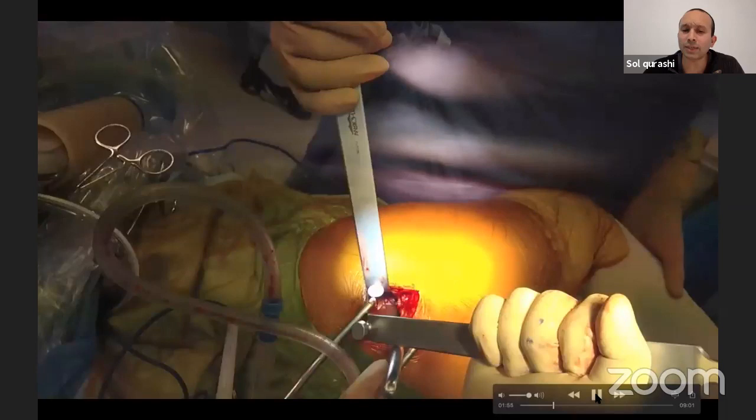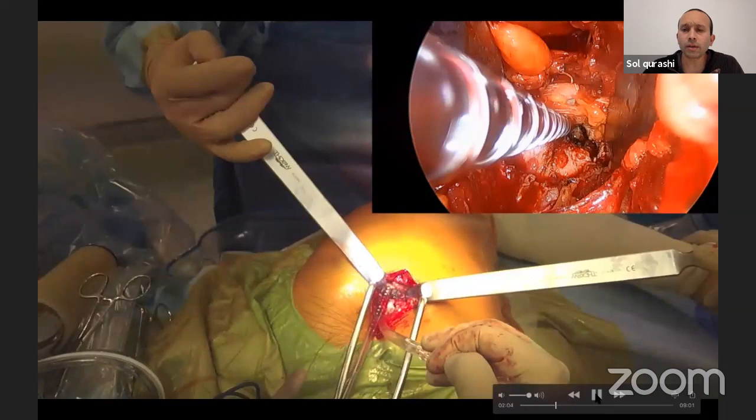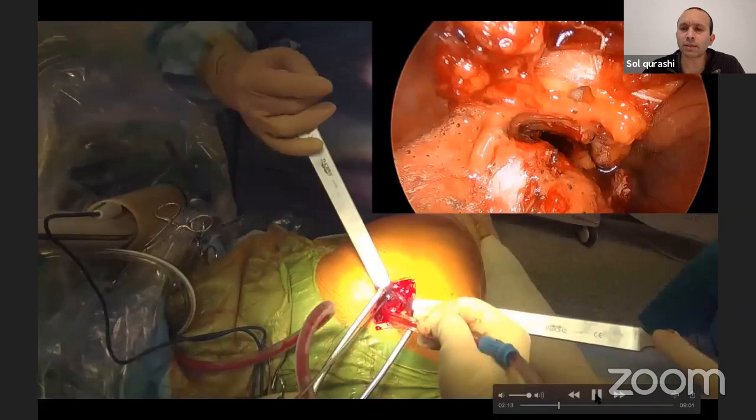Then I'll create with a drill an opening into the top of the femoral canal. Once I've done that, I'm going to check with the guide wire to make sure I'm in. I have on a couple of occasions come out of the side and we've had to rectify it, nothing too major. You just dilate that hole a bit more with a bigger reamer, like a gamma nail reamer.